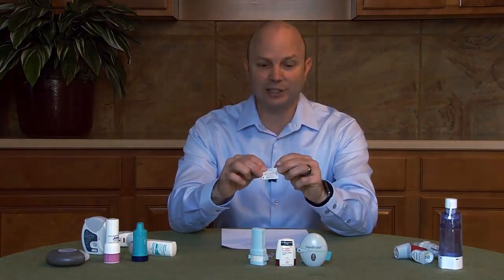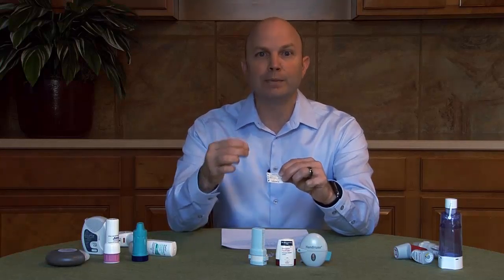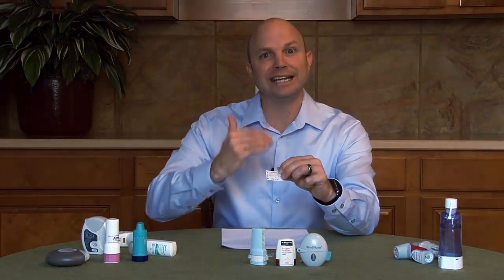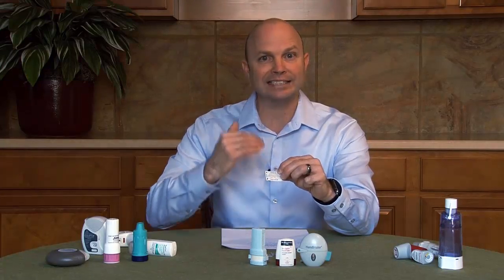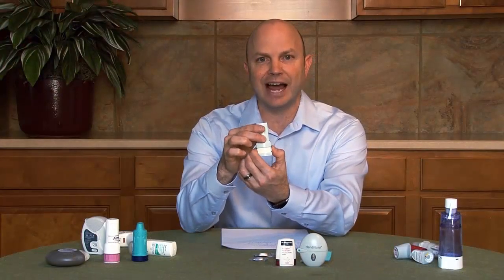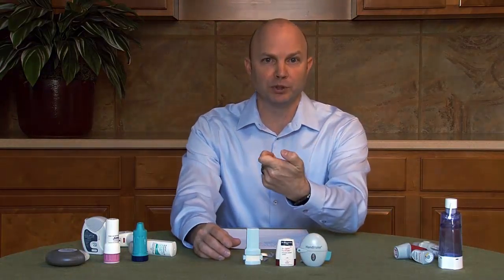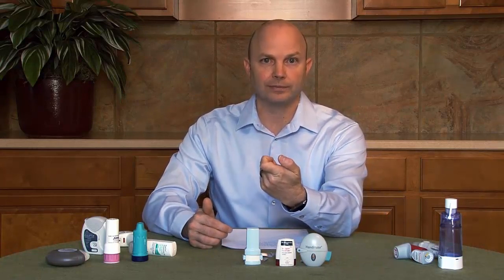The breathing technique with all of these dry powdered inhalers is a fast, deep breath. Remember, it's a powder that you need to inhale inside your lungs, so it requires a fast, deep breath. The other important note is when you use the piercing device, you only press it one time. If you press it multiple times, you'll actually cause some fragments of the plastic capsule to become dislodged, and you might inhale that into your lungs. So only pierce the capsule once.